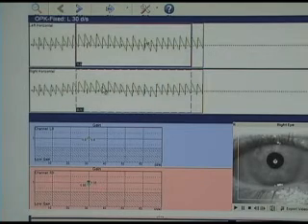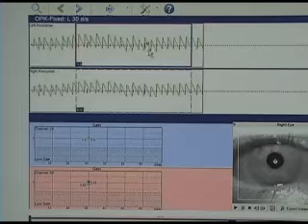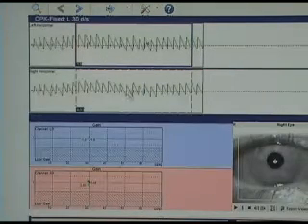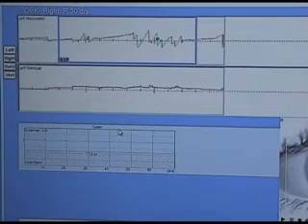So if this patient has a very healthy left brain because they've got a very good response to their optokinetics, it should look like a saw almost, or like a bread knife, real jerky, and it should be nice and even all the way through. The frequency should be the same. And the amplitude, which is how tall the graphing is, should be pretty much even all the way through. So this would be somebody with very good brain function, at least to the left.